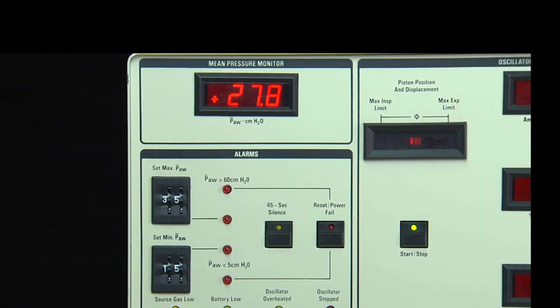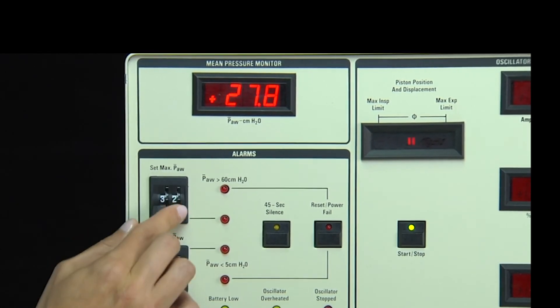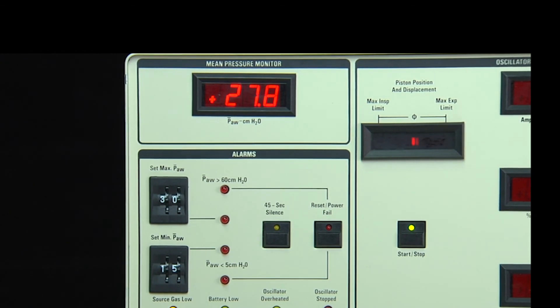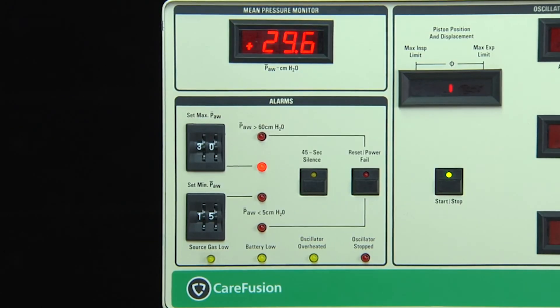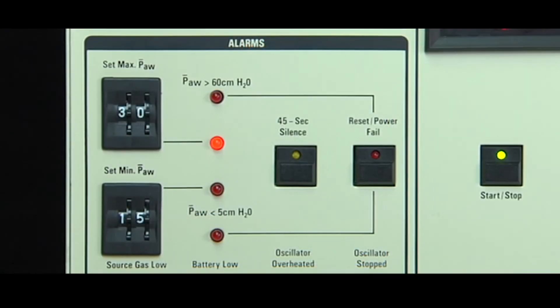Thumbwheel controls are used to adjust the set maximum and set minimum mean airway pressure alarms from 0 to 59 cm of water pressure. The set maximum mean airway pressure will provide an audible and visual signal when the alarm threshold has been reached. Additionally, activation of this alarm will trigger the Autolimit system, which will briefly open the limit valve on the inspiratory limb of the circuit. The circuit pressure will fall by approximately 12 centimeters of water pressure, then the valve will repressurize to its operational state. However, the visual alarm will remain on.